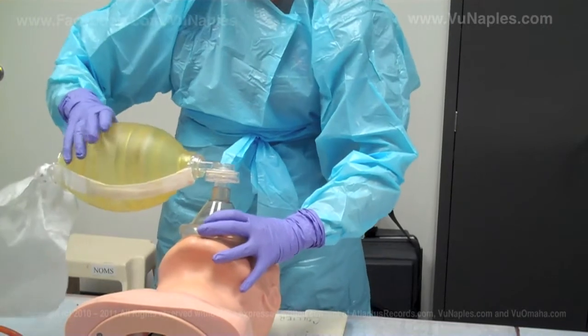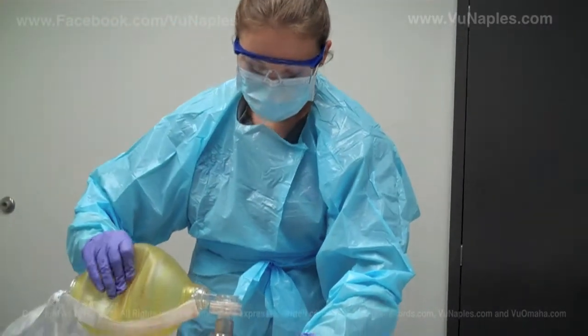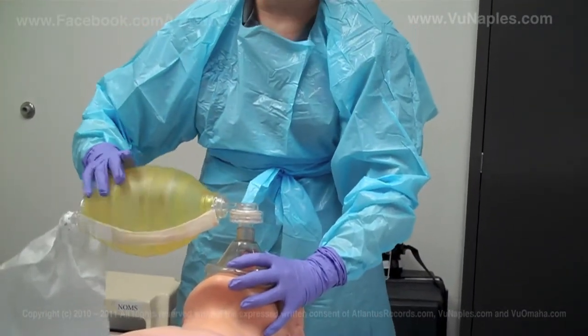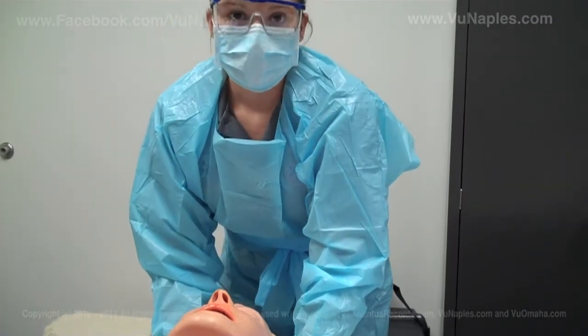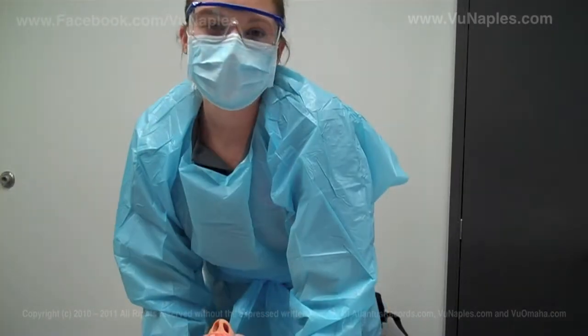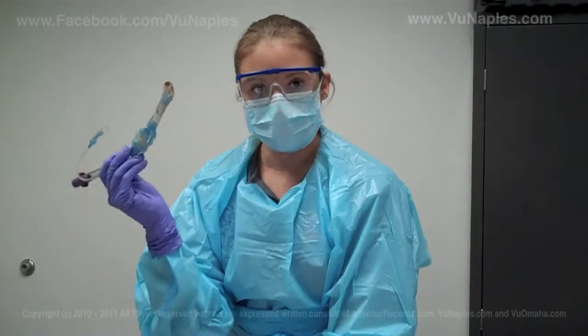To remove the food or any obstruction from the patient's airway. What I'm doing now is bagging the patient with oxygen, pre-oxygenating the patient before I insert my king tube. The king tube is for the purpose of opening the airway in place of using an ET tube. An ET tube is an endotracheal tube, a tube that a paramedic will use. It's an advanced airway placement. This is a basic airway placement.